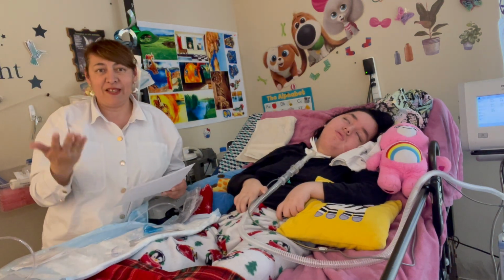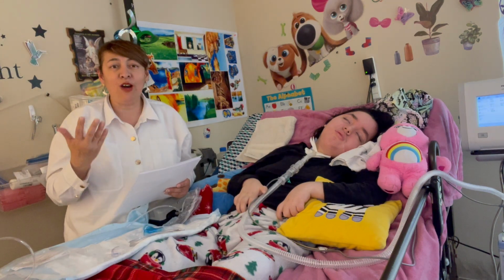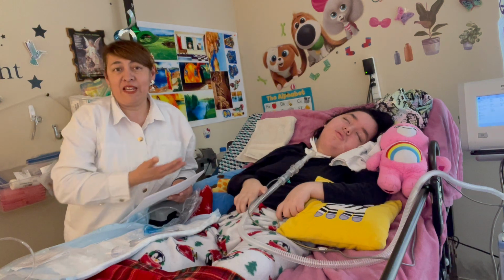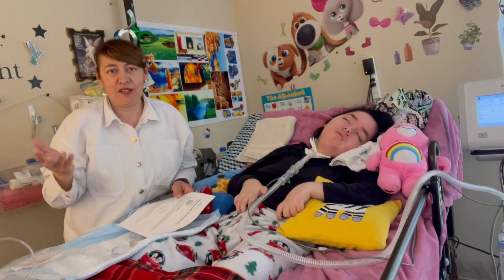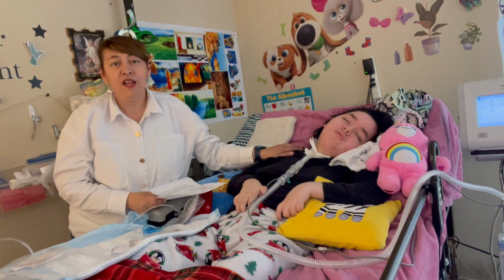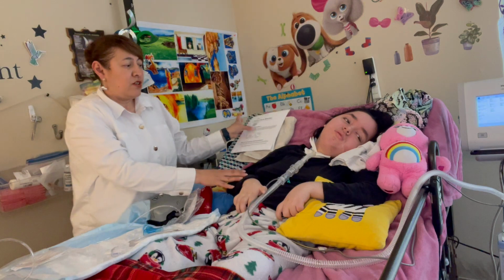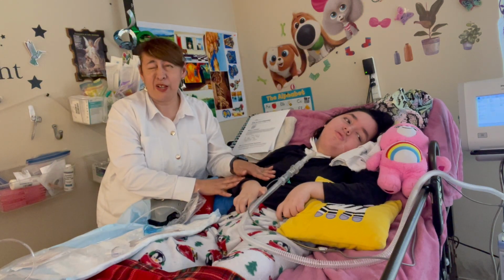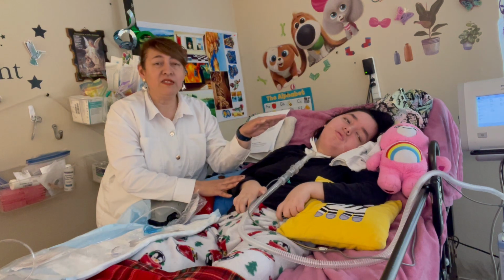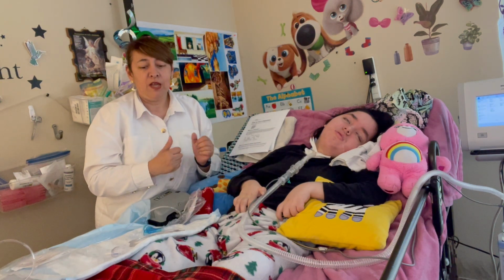Hello, my name is Sandra, and I'm going to do my presentation regarding how to nebulize a patient on a ventilator, or in general. In my case, my patient is my daughter, who is connected to the ventilator because her diaphragm is not working properly, so she needs the ventilator in order to keep her lungs moving.